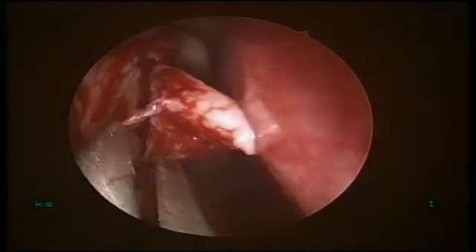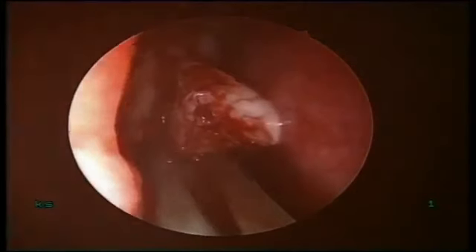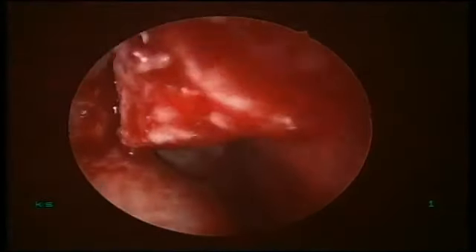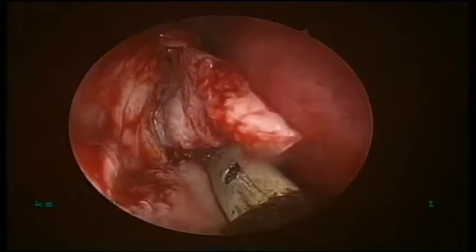Scissors. That's the prominence of the nasolacrimal duct.